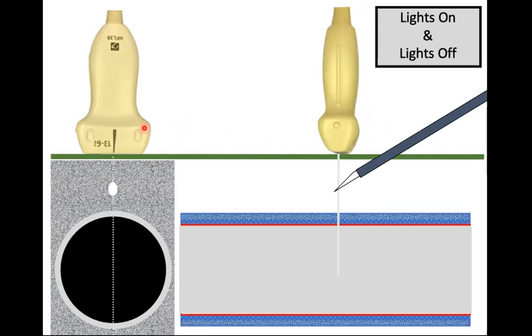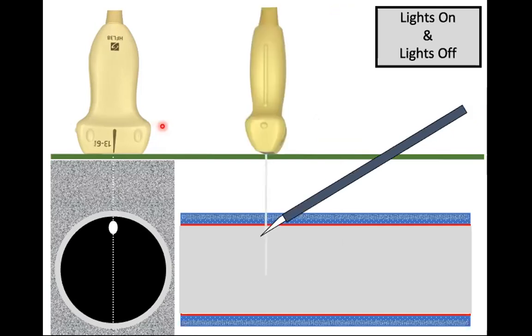And you'll get to practice this in the skills lab and on an individual basis. Okay? I'm going to take a jump here. I'm going to come down here to the vessel. All right. So we've got our needle and it's into that wall. Here's our image, right? This is what we can see. We get a flash in our needle. We're doing our happy dance. We're like, yeah, baby, I'm going to slide that catheter off.